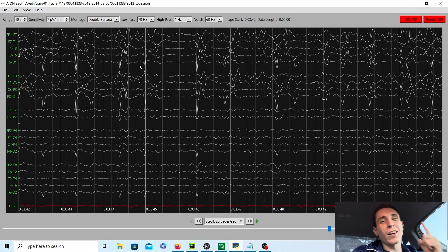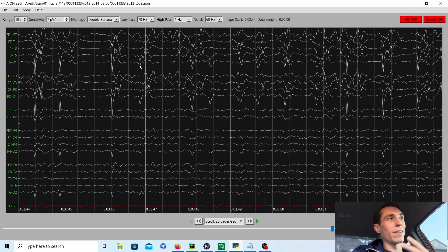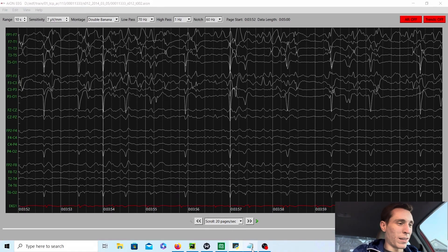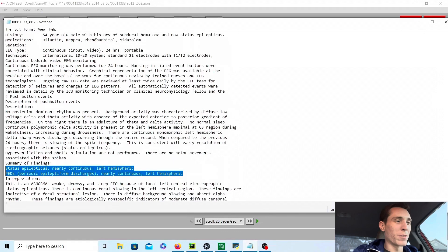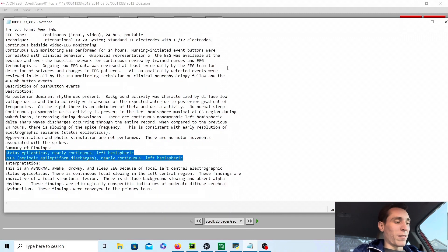The patient is already on anti-epileptic drugs: Keppra, Dilantin, Phenobarbital, and midazolam — that's a benzodiazepine. So they're already trying a lot of stuff to stop it. That's continuously seizing — status epilepticus — nearly continuous, left hemisphere on the left side, as we saw.